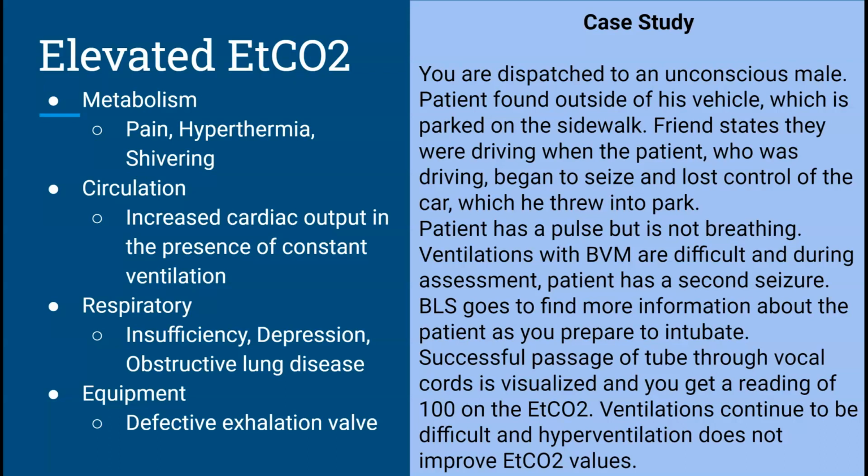All right, cool. So a number of things that can cause elevated end tidal in capnography is definitely metabolism, right? If you have any sort of reason that your body is going to burn more oxygen, if you have a high oxygen demand, so any sort of level of pain, hyperthermia, if you're shivering, right? Because shivering recruits a lot of muscles.